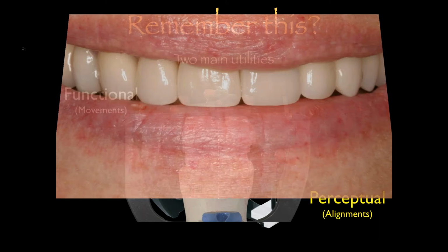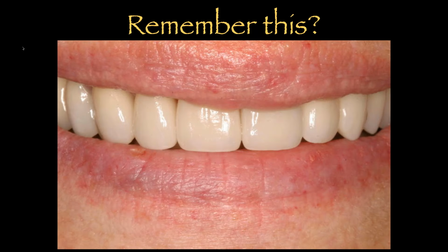Now, going back to the use of the articulator, and I went over this, I'm sorry, but the perceptual alignments of the articulator that help us keep the horizontal, horizontal, and the vertical, vertical. I want to show you this case real quick.